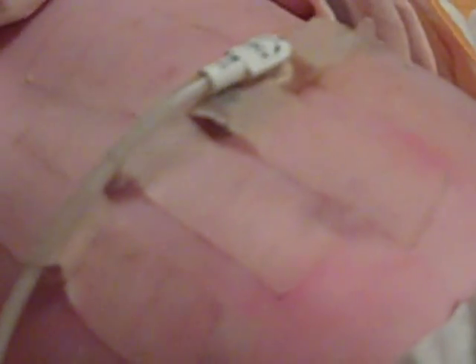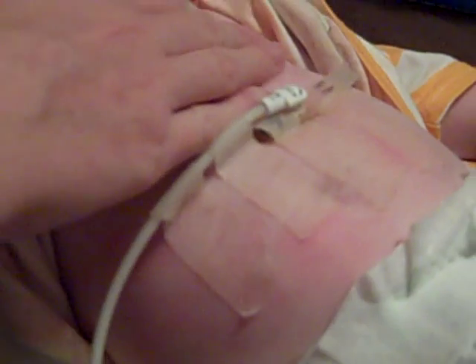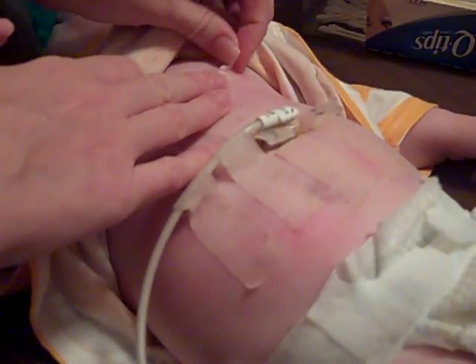The best way to get this off is just to clip, and then clip, and you have to do it while your moving target is moving. Put those down for a minute. Here you go. There you go. And then you're going to want to clip here, and see, that just comes right off. And the tape doesn't hurt anyways, but it's a little stuck. But it just helps take off all that adhesive.